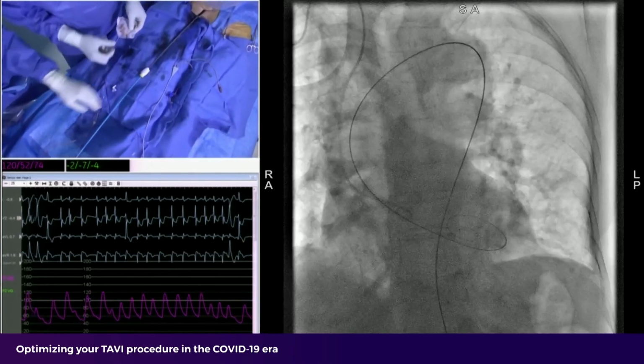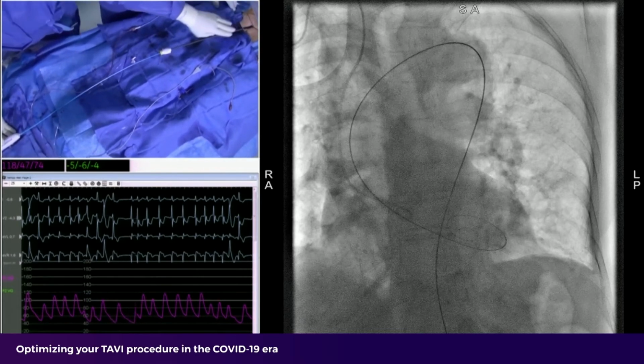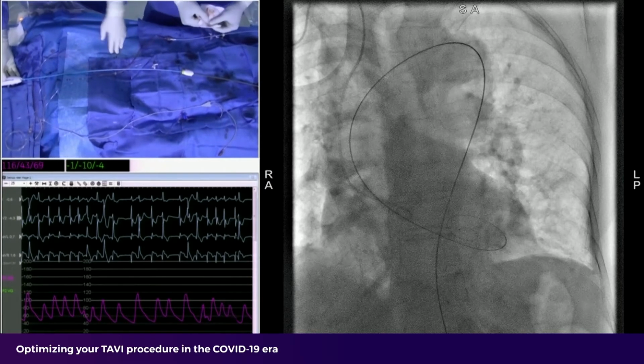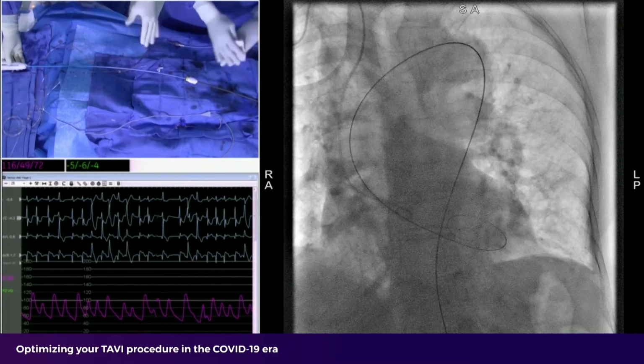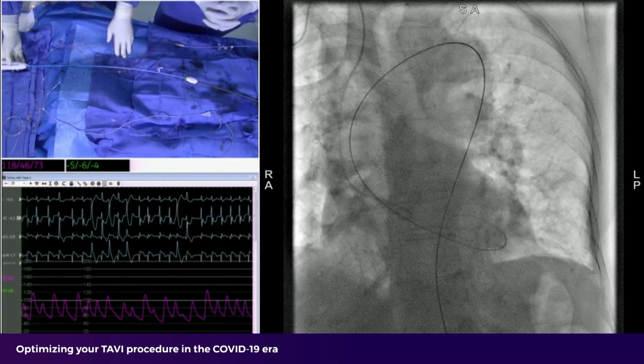Yeah. So just at the level of the skin, Didier, you entered the nose cone and the distal capsule, and I think you told that it's important to emphasize what is really striking here is the hydrophilic performance of this tip of the catheter that makes it navigate through the vessels and the tortuosity really easy, and it's really an original feature I think we felt.